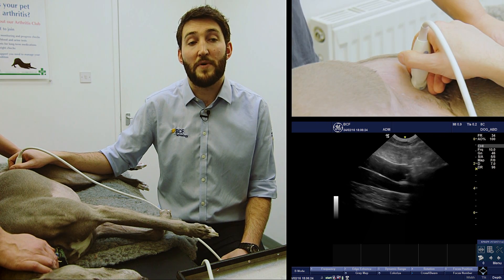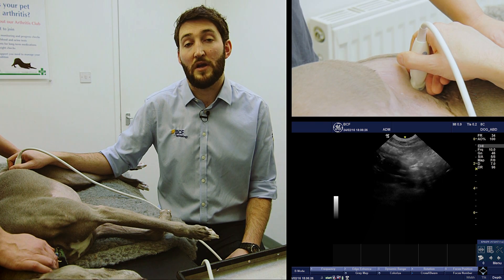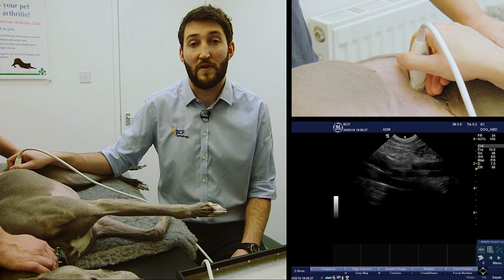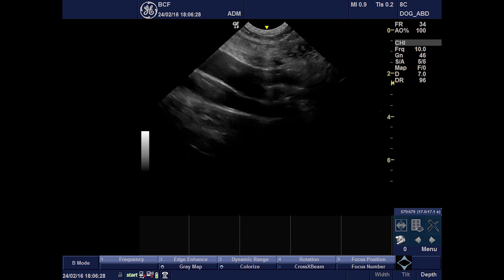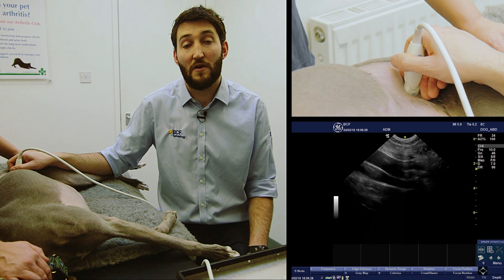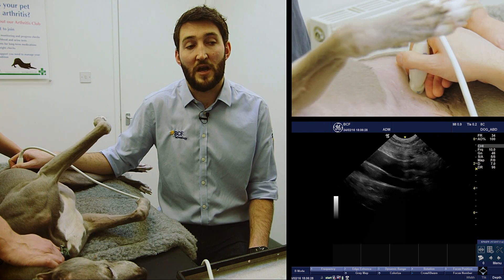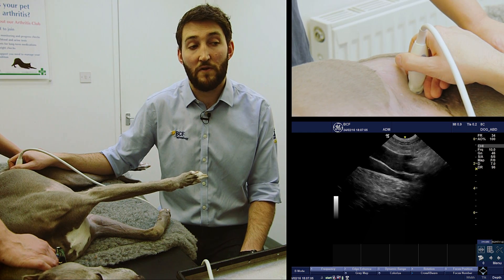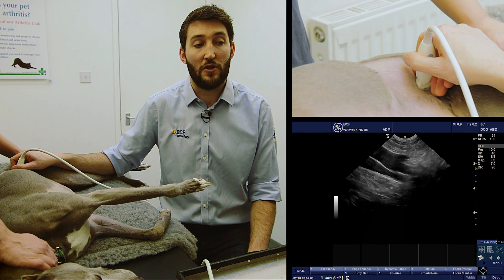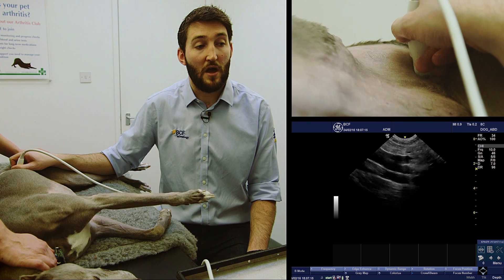We want to get the bifurcation in the centre of the screen. The medial iliac lymph nodes are going to lie on the outside of the angle of the bifurcation. We have the Y formed by the external iliac arteries — left towards the top of the screen and right towards the bottom. The medial iliac lymph node lies in the angle formed by the aorta and the external iliac artery, laterally and ever so slightly ventrally to the vessels. Minor fanning movements up and down whilst watching the screen can help localize those structures.